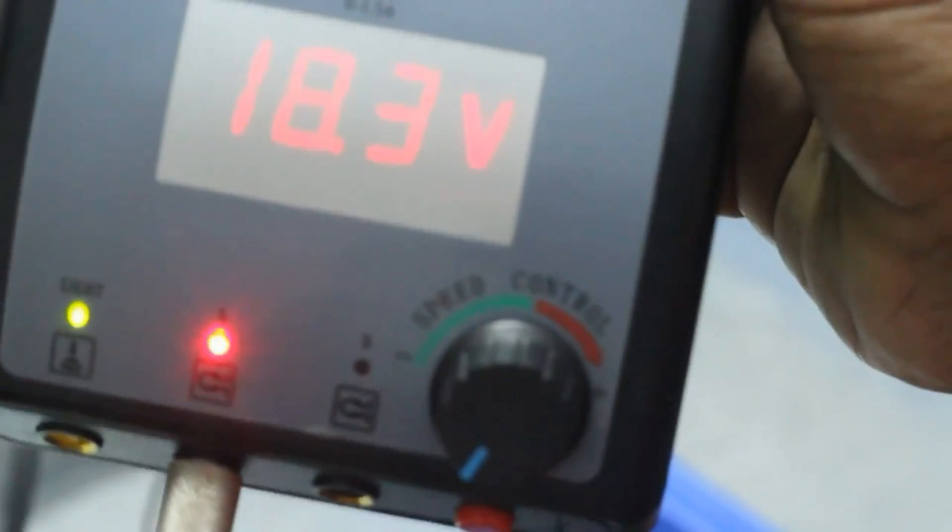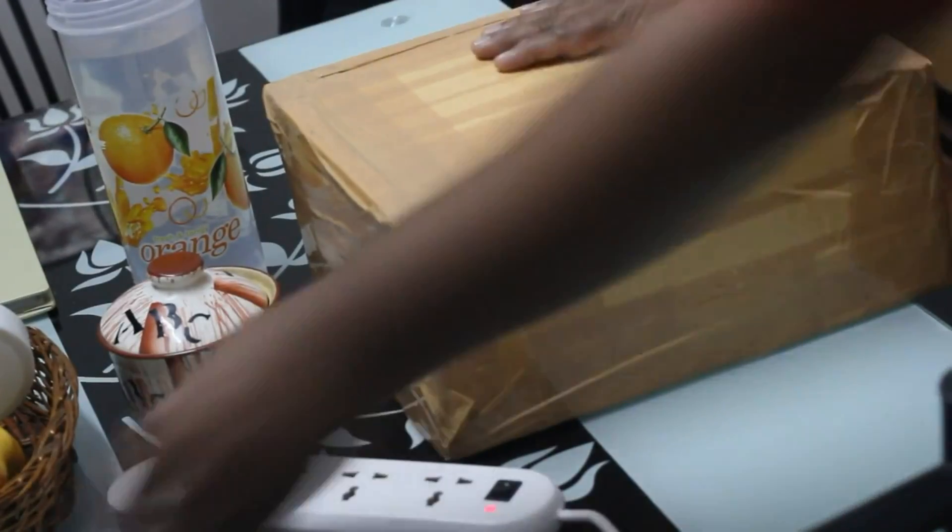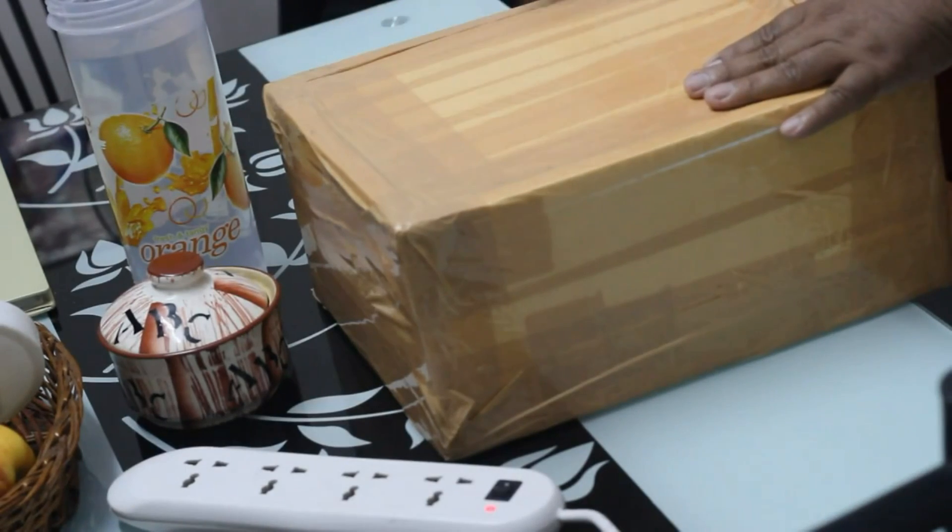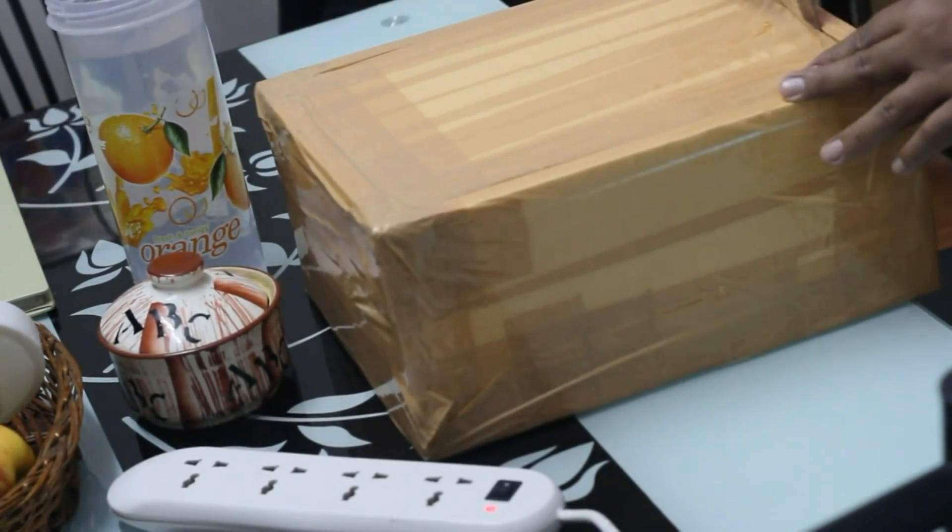The maximum intensity is 18.5 or 18.3 in some devices, and the minimum is 1.5. The more intensity you do, the better the results for sweaty palms and feet. It will bring dryness. Let me demonstrate this.